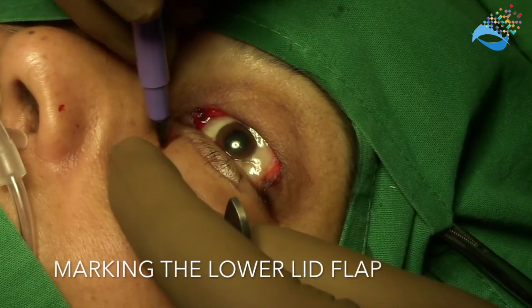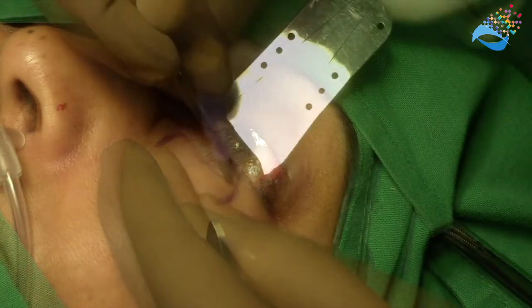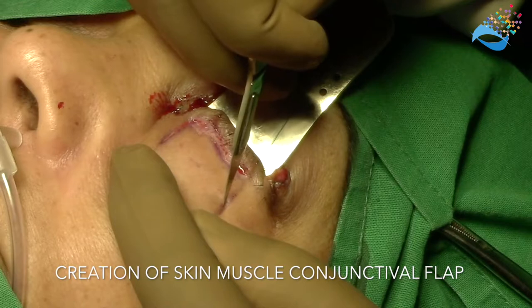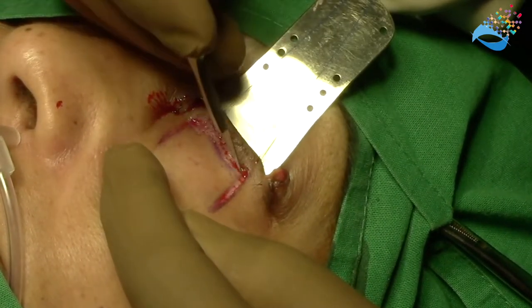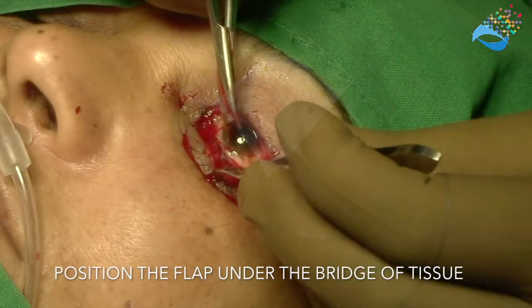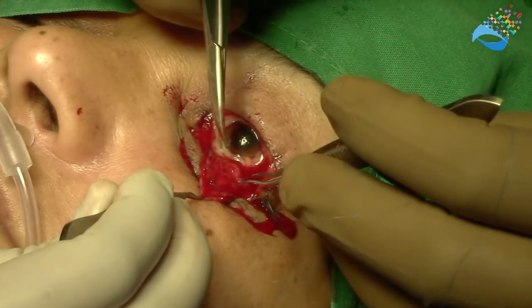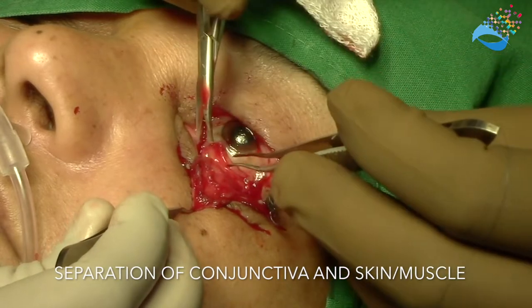Corresponding to the size of the defect in the upper eyelid, an advancement flap is fashioned in the lower lid. This skin-muscle-conjunctival full-thickness flap is in the shape of an inverted U. Care should be taken not to damage the tarsal plate of the lower lid while creating this flap. The flap is then pushed through underneath the bridge of tarsal tissue and separated into the anterior and posterior lamina.